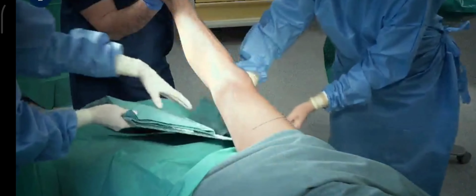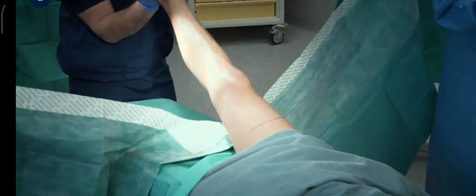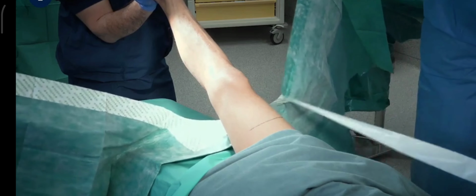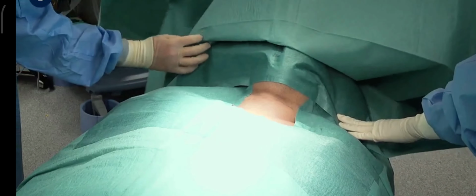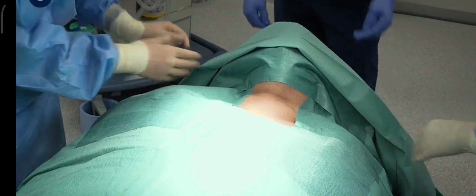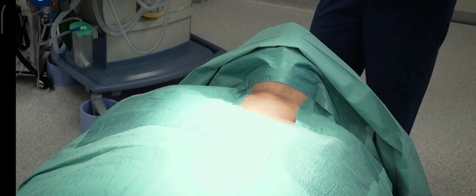Surgical draping techniques and types vary widely between hospitals and procedures. The objective, however, is always the same, and that is to build a sterile field upon which surgery can safely be performed. In this film, disposable adhesive drapes will be used to show a number of techniques.